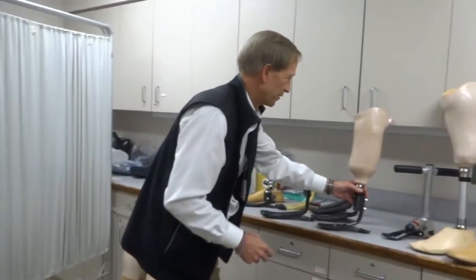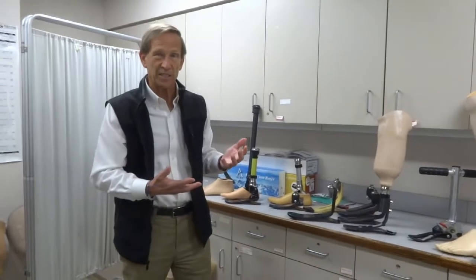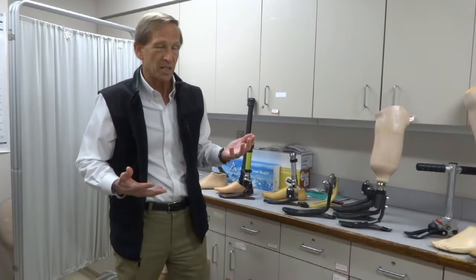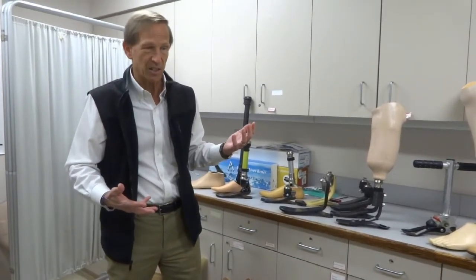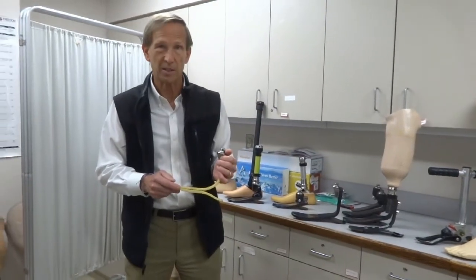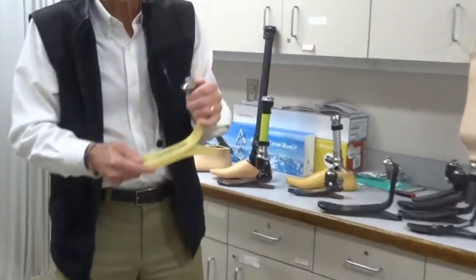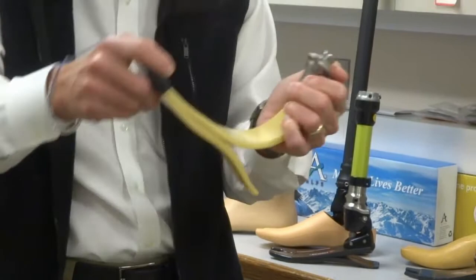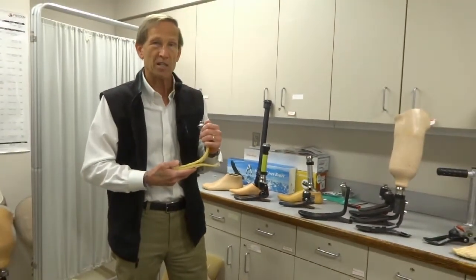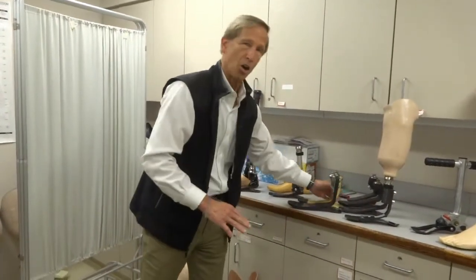These feet come in a variety of configurations. They allow for different heel heights, different activity levels for running and jumping, and different weight categories — typically up to three to four hundred pounds if necessary. The yellow one here is a fiberglass composite, which has the same characteristics as carbon fiber — it bends and springs back — but with a slightly smoother bending motion. In the near future, more and more prosthetic feet will become fiberglass composite instead of carbon fiber.